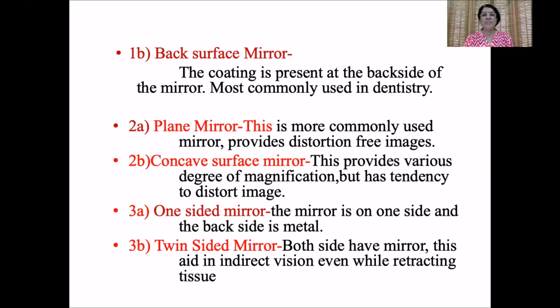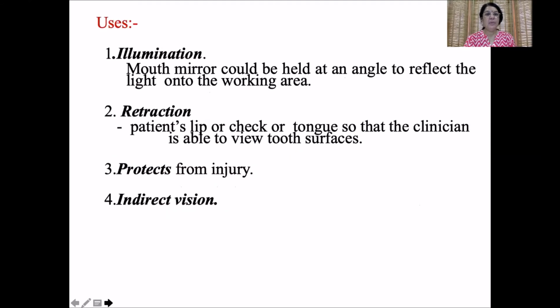The advantage is that when using it in the patient's mouth, you can also visualize the surrounding soft tissue clearly. So this was about the mirrors.